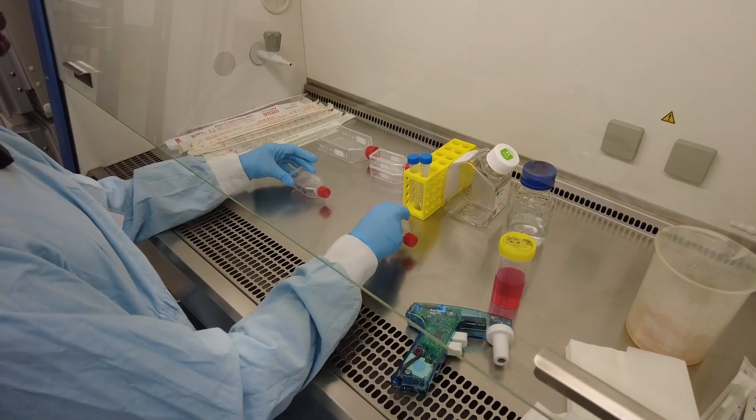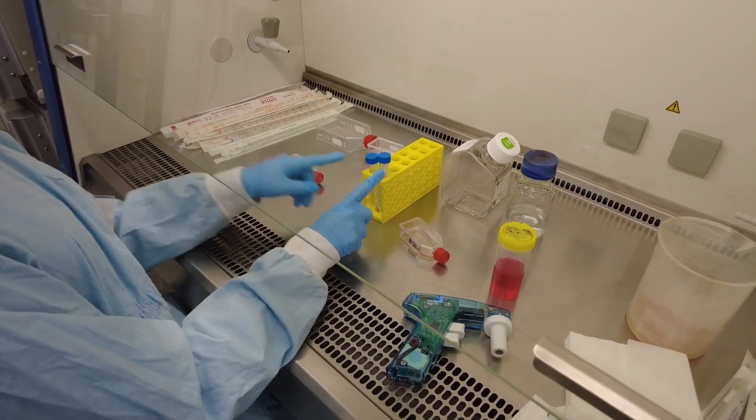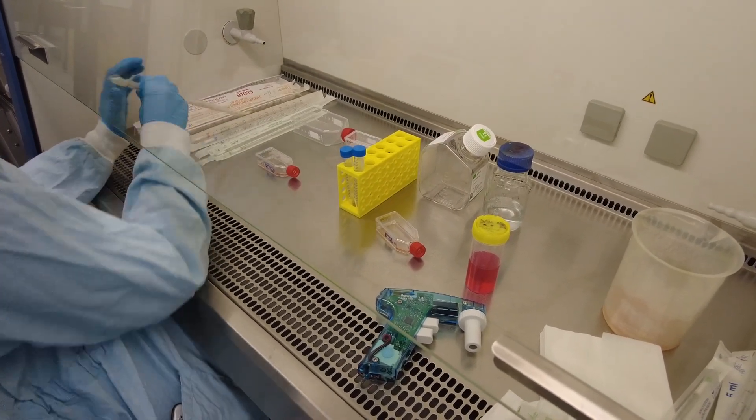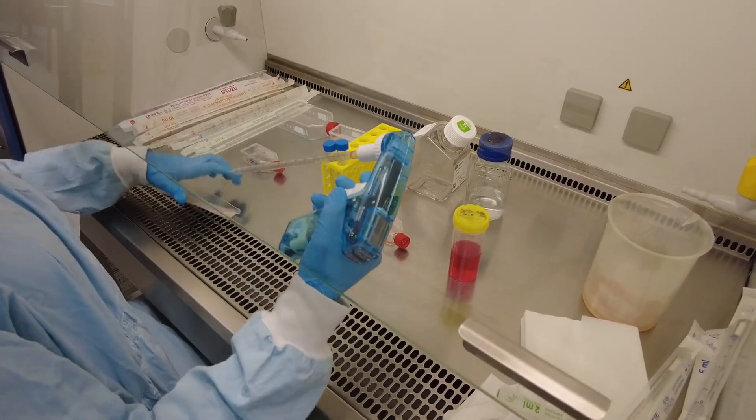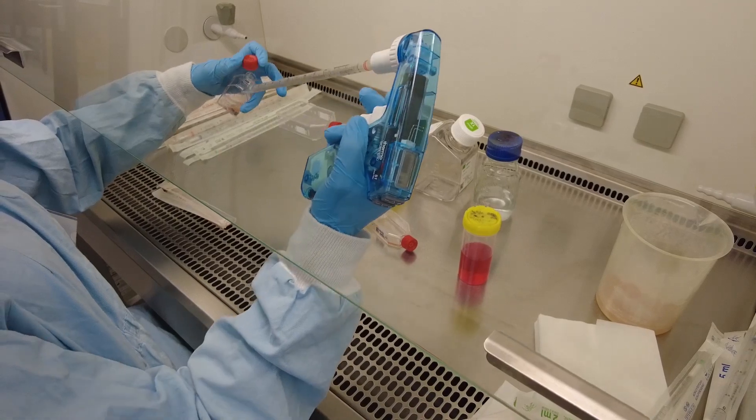Now each flask is going to go into an individual centrifuge tube. And then we're going to centrifuge it for about 10 minutes so we can get the cell pellet.